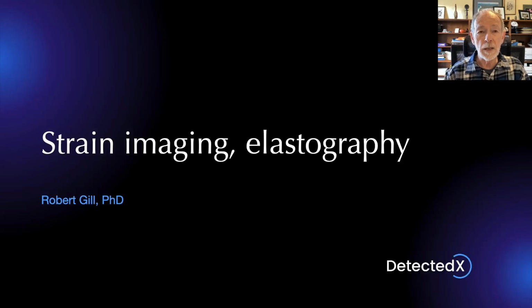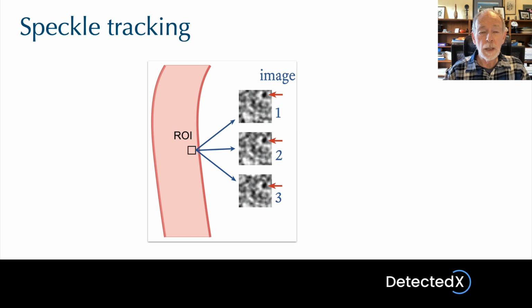Finally, in this last lecture, we'll take a look at some newer technologies, in particular strain imaging and elastography. I'll begin by talking about a technique that's fundamental to these that's called speckle tracking.